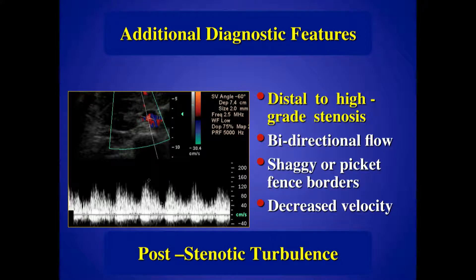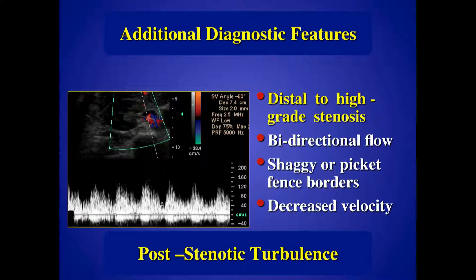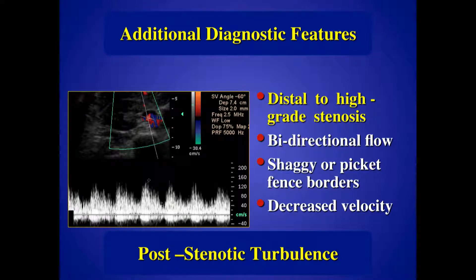We see these distal to just about every significant stenosis. It's bidirectional because when those red blood cells come spilling out of the stenosis, they're moving at different velocities in different directions, giving you that chaotic appearance. Some people call it shaggy picket fence; my friends at Cleveland Clinic call it Bart Simpson hair. They tend to have very low velocities because as they shoot out, they're losing energy, pressure, and velocity. You can go from a very high velocity waveform in the stenosis to this turbulent low velocity waveform in the post-stenotic space.